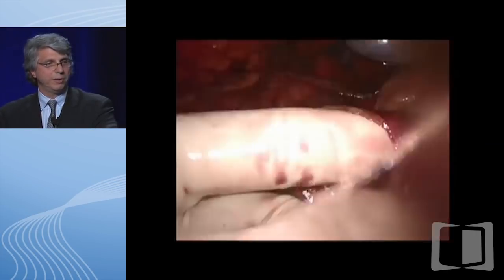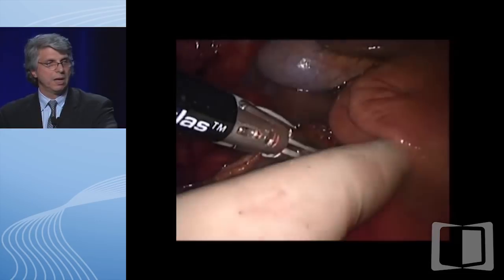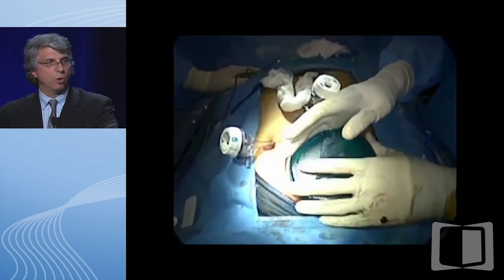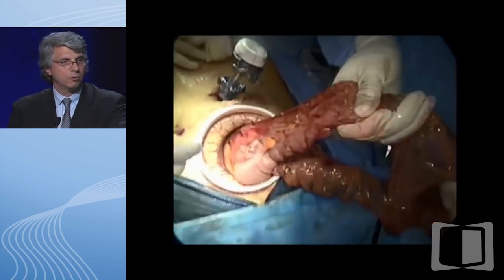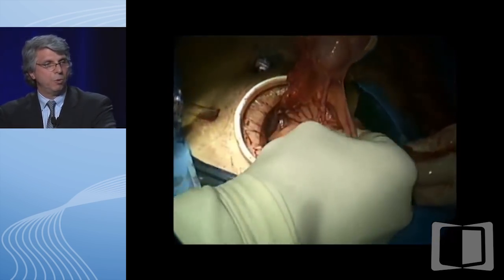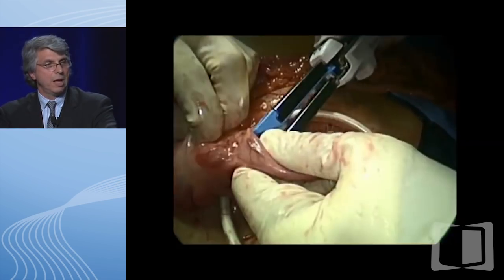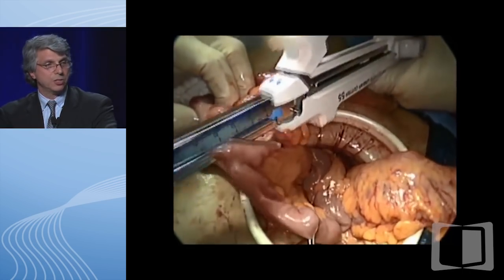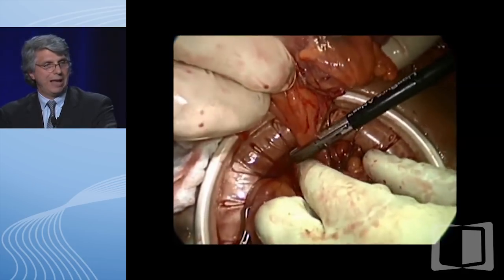This is all being done with the assistance of a hand. It can be done totally laparoscopic, though that does take longer. Once that's done all the way down to the left colon, we take some more of the attachments of the terminal ileal mesentery. We're now back on the right side—you can see the gallbladder in the distance. The gel port is removed and the colon is mobilized up and out. We then identify the terminal ileum. The only place on the small bowel where there's anti-mesenteric fat is at the terminal ileum, so we take that wad of fat off, then transect the ileum flush with the ileocecal valve. That staple line will eventually become the efferent limb of the J-pouch.